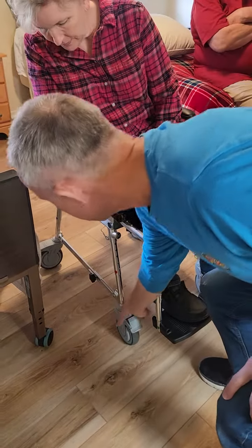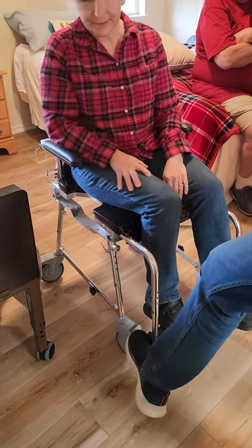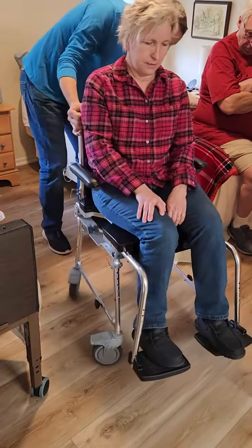When it's locked, they can't rotate and they can't move, so they're completely locked. To unlock it, I'm just going to step on it. Now the chair spins freely.